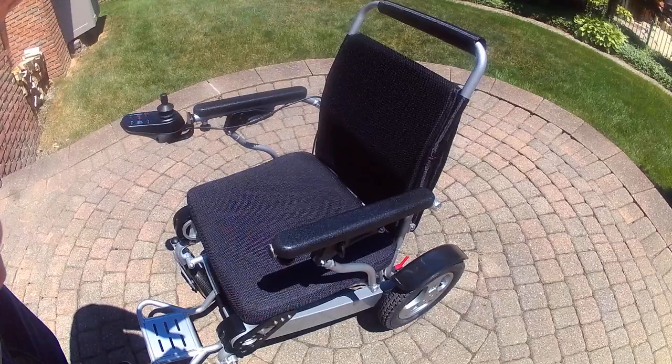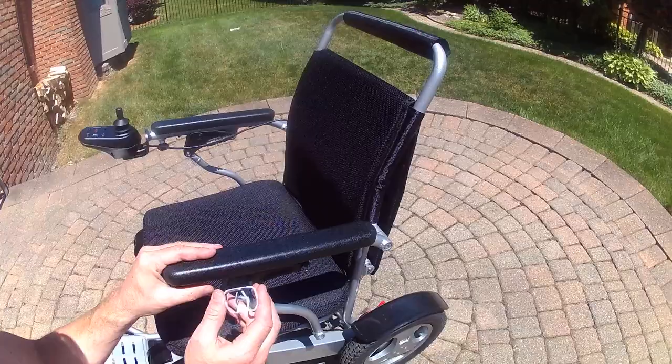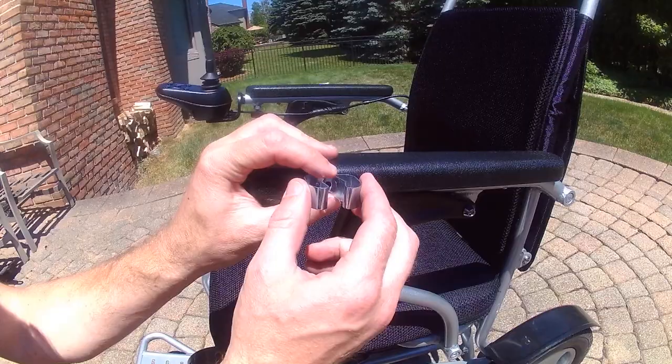I would caution you that this would void the warranty, so you would probably not want to drill a hole into the arm and attach it. However, what you could do is purchase Velcro and attach Velcro to either side.